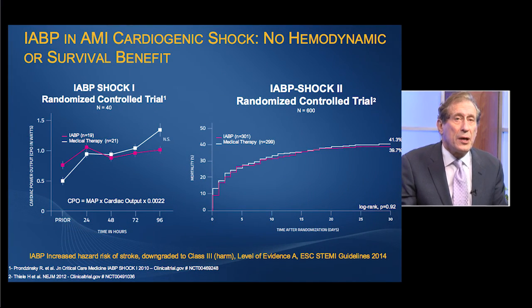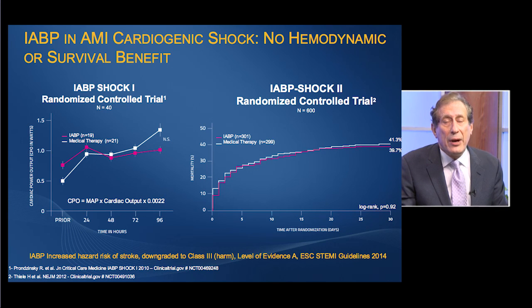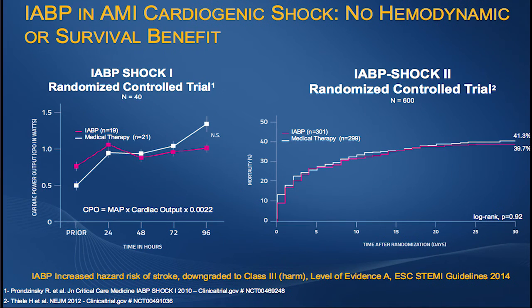The other mainstay of treatment up until recently has been the intra-aortic balloon pump, which has been around for decades and has been a simple and easy to apply technology. But however, to our disappointment, in the SHOCK 2 trial, when you looked at IABP as a primary therapy versus medical therapy as an adjunct to PCI, we saw absolutely no difference in mortality up to 30 days, with the standard recurrent 40% mortality in these clinical trials. So that was a big disappointment that a standard therapy that we've been using for decades really doesn't seem to have the effect that I think we assumed.